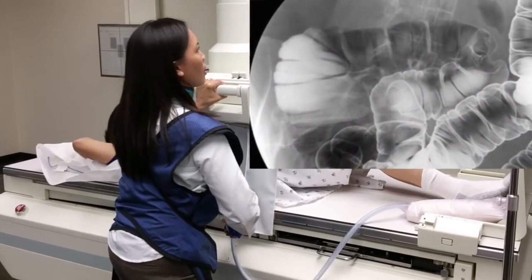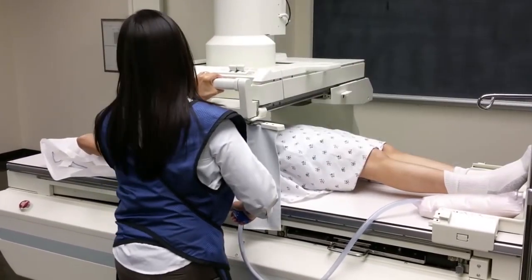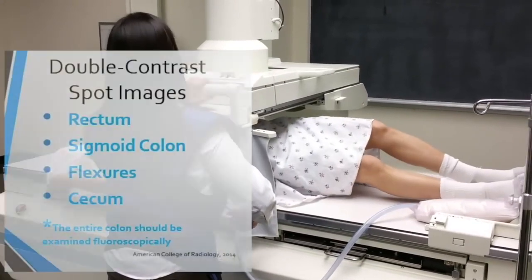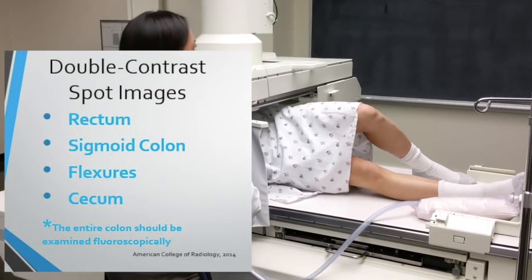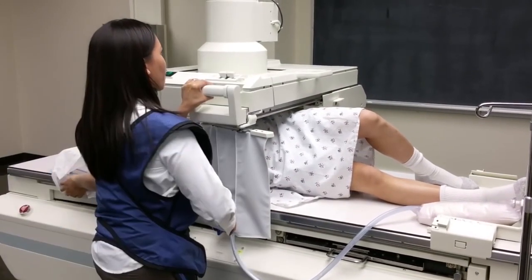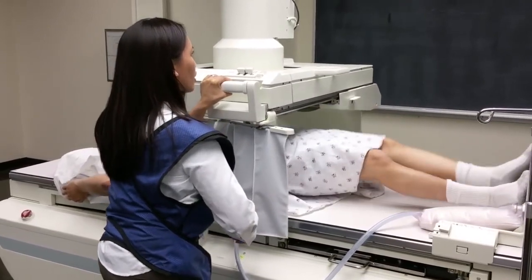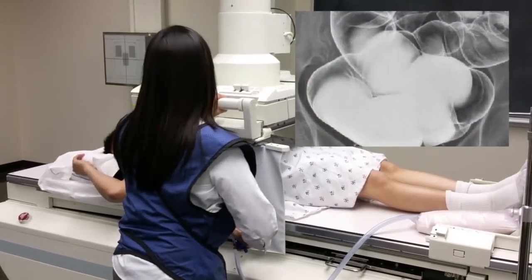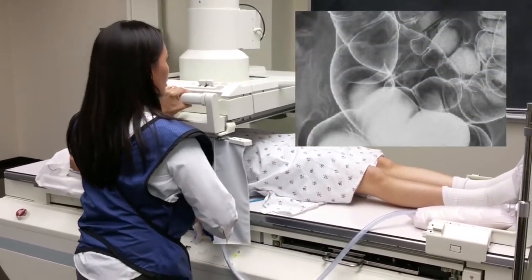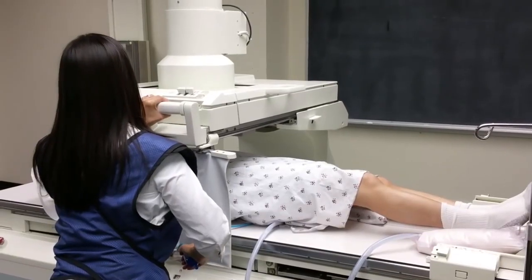During this point of the exam, you need to be flexible yet compulsive. Spot images are taken of the rectum, sigmoid colon, hepatic and splenic flexures, and cecum. But the order doesn't matter so much as long as each loop of colon has adequate barium coating and distension and is demonstrated with as little superimposition or overlap as possible.